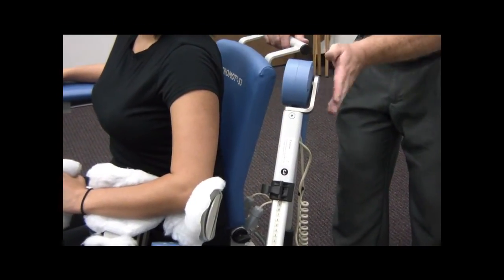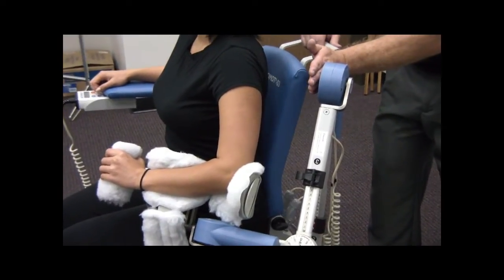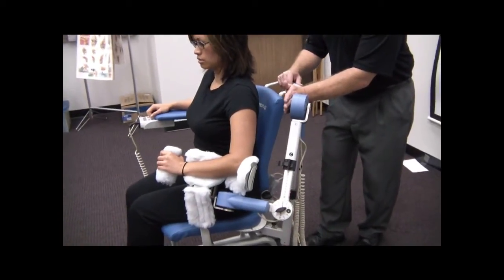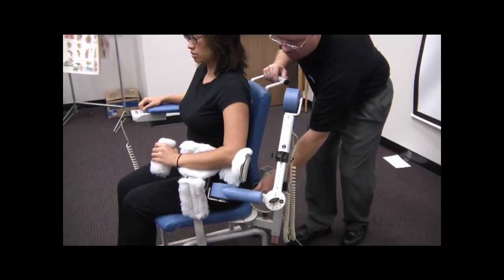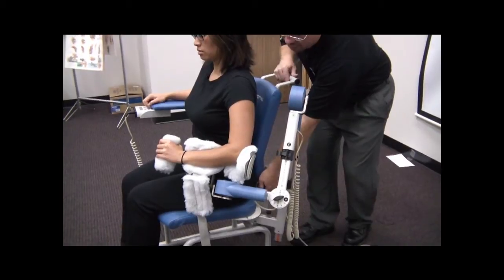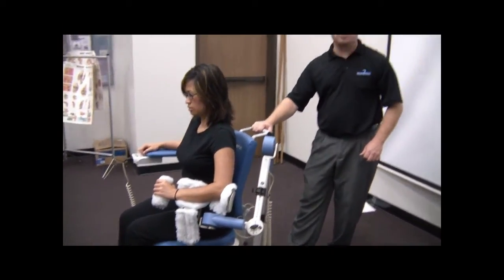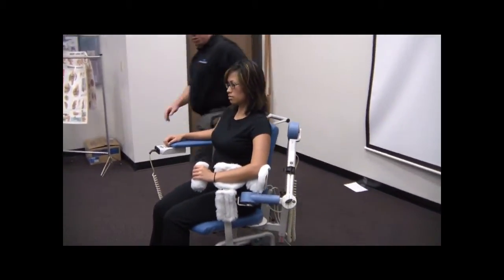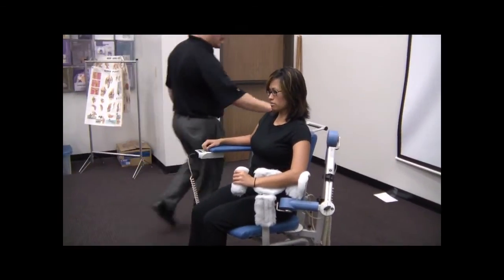Now, we can't lay back. It's got to be far enough that we're not going to bring the patient into the motor. So we are limited a little bit here, but we can get the patient to a comfortable level, either back or more forward, and then we want to lock this into place. It has to line up at a certain point for it to lock into place, and you want to make sure that you tighten that knob really good and that this isn't going to come loose and they fall back. So I'm going to ask Ann to go ahead and sit back, and then I'm going to check with her to find out if that's a comfortable angle for her. And it is. So we're okay here now.